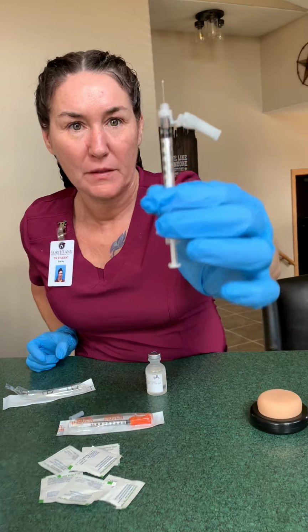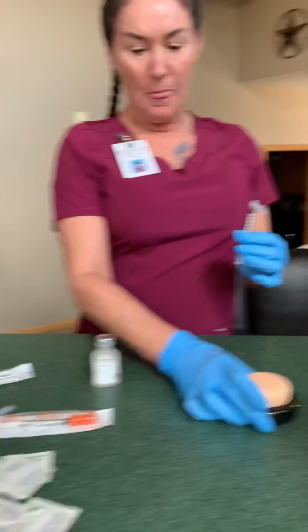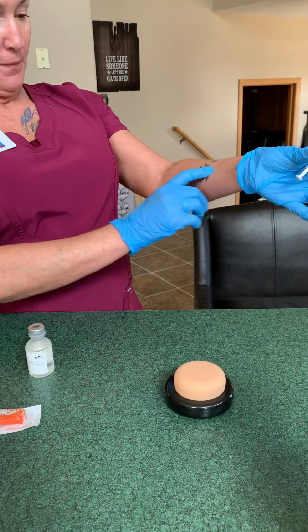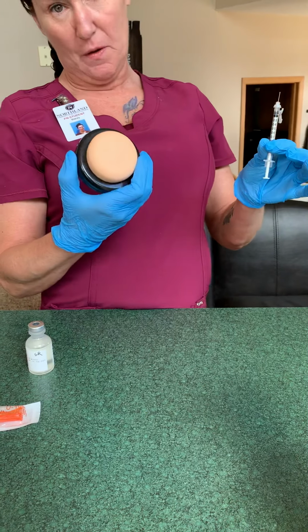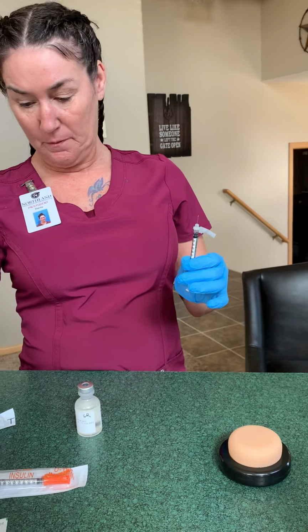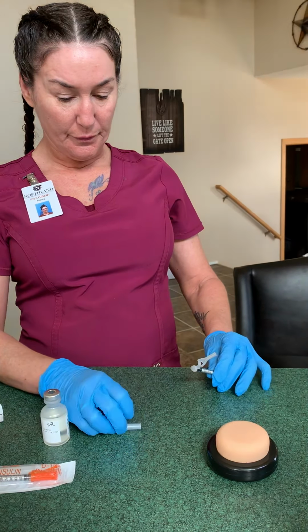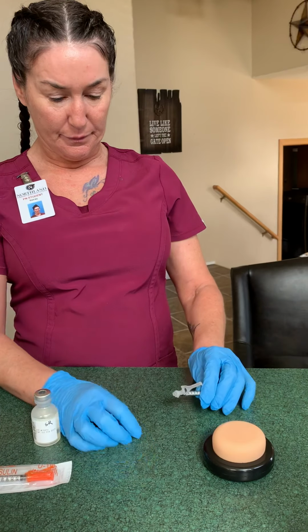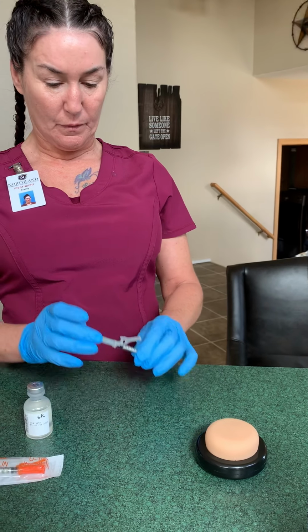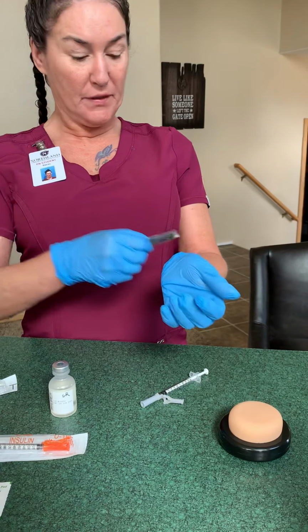And then when we have that, we'll want to prepare our skin. A TB test is given right on the inner forearm of a person. For our purposes today, we'll be using an injection pad. And I'd want to start by preparing my pad or preparing the skin.